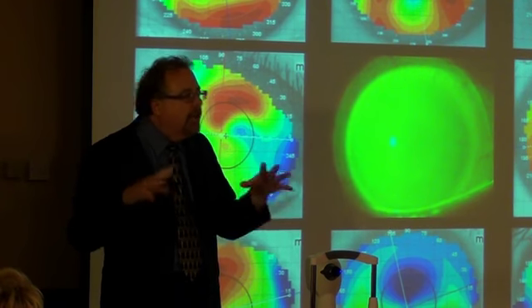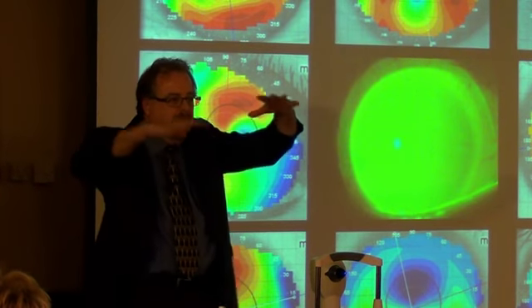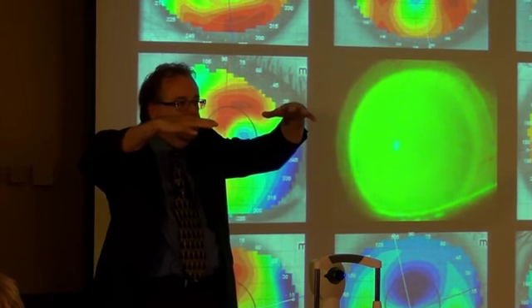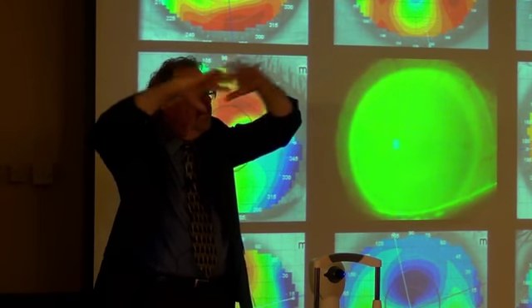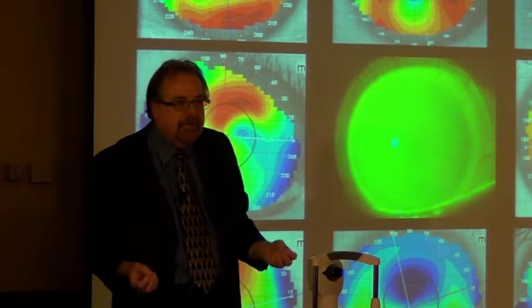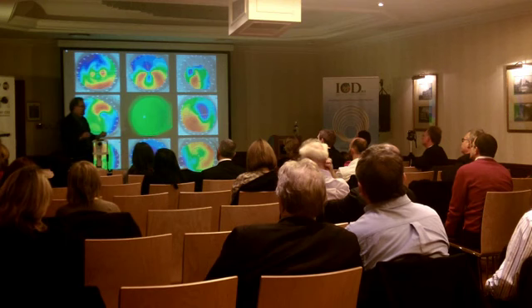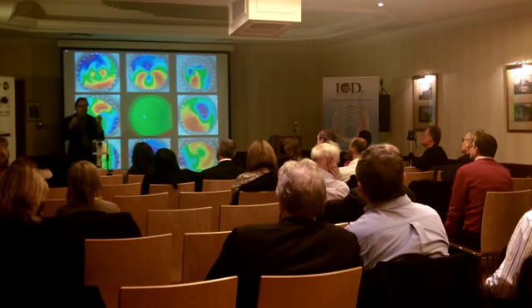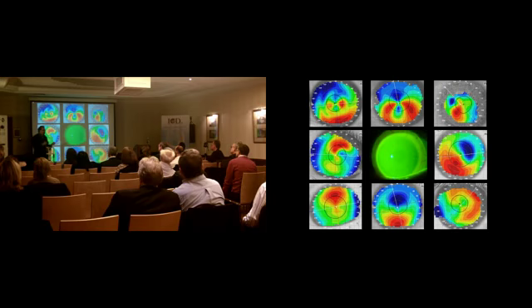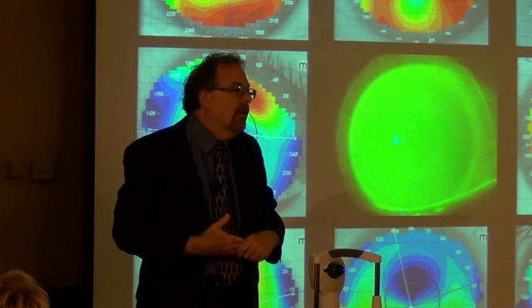These lenses offer each one of us the opportunity to take patients where we have those dramatic height differences in the cornea, and it allows us to just simply vault over it. That's all these lenses do. They're nothing mysterious. They're nothing magical. The results we get are magic, but the actual design of the lenses is designed to accomplish just those things. Clearance of the central cornea, clearance of the mid-peripheral cornea and limbus, and ultimately that lens resting on the sclera.